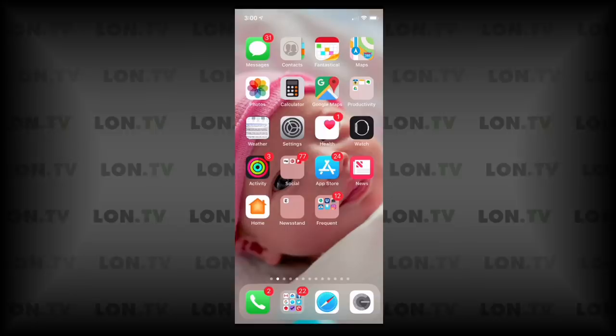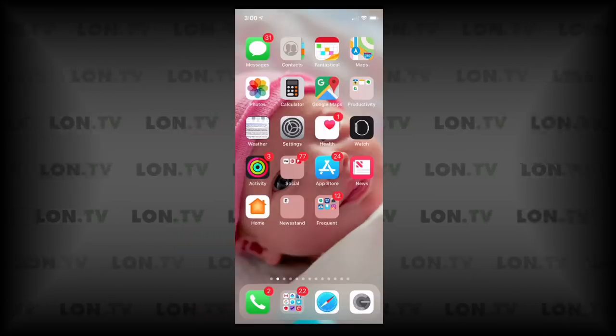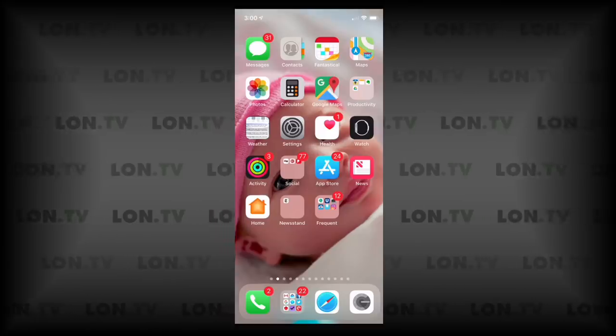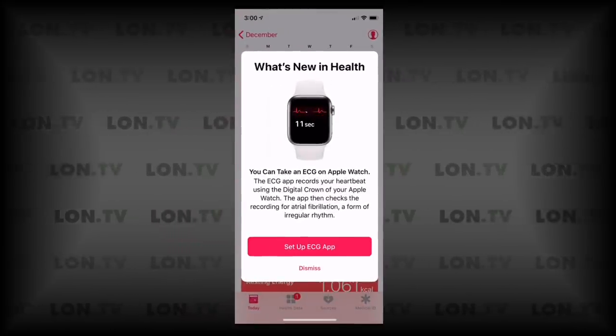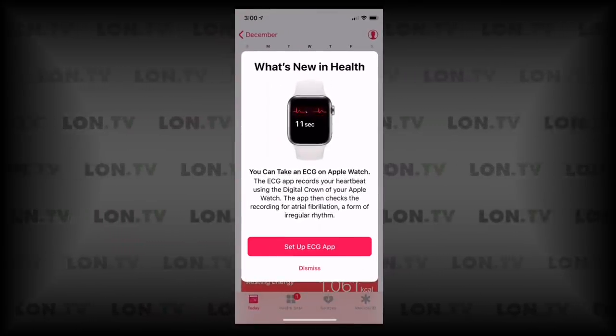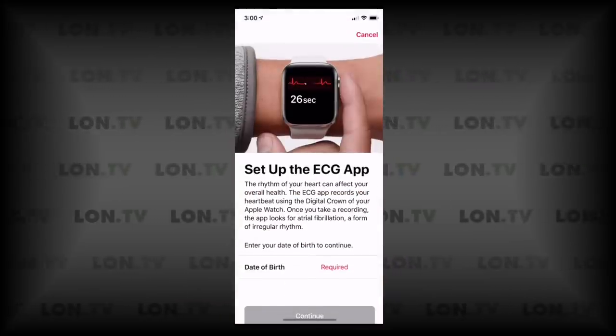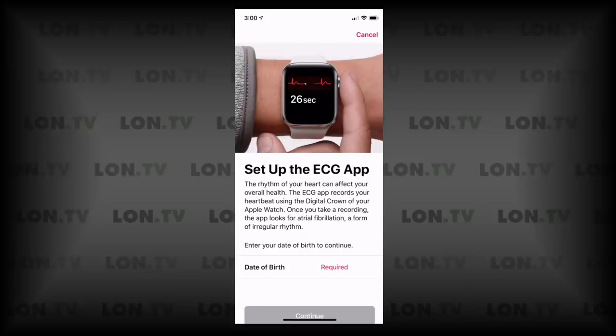So let's get into it and see how this works. The way you activate this feature is to first make sure that your watch and your phone are up to date, so get those updates installed first. After that you go over to the Health app, and you can see we've got this option here to set up the ECG app, which is what I'm going to do right now. I'm going to tap on that and it will ask for my birthday, so I'm going to put that into the phone.